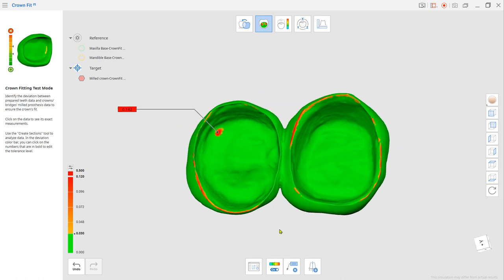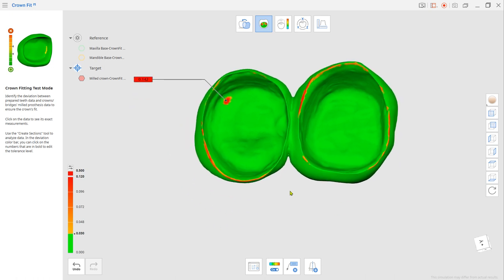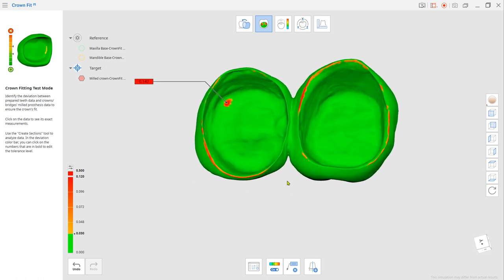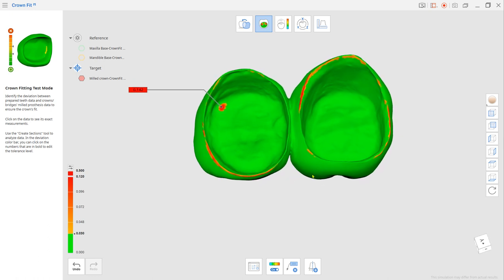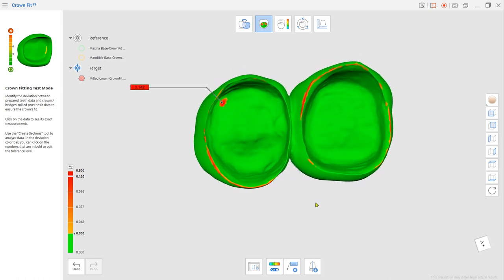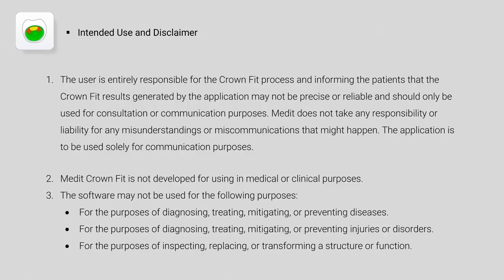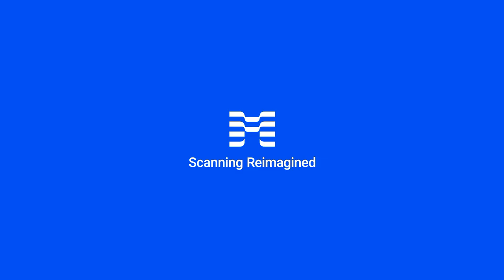This is how you can check the crown's internal fit without having actual CAD data.